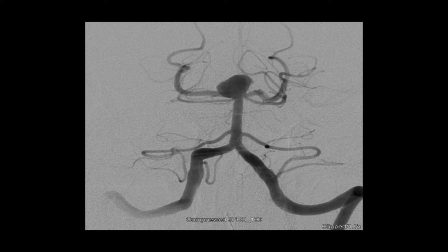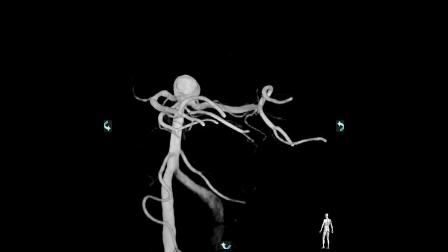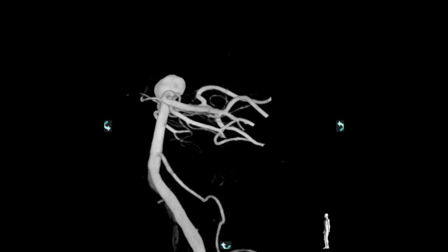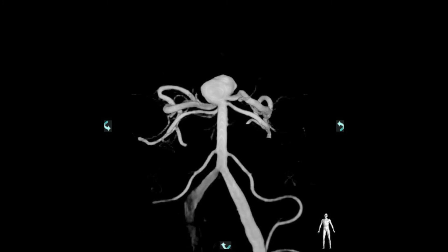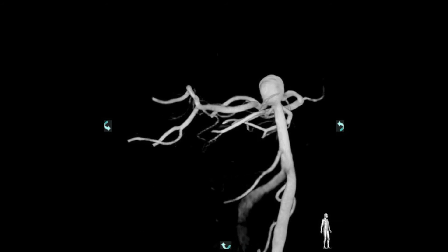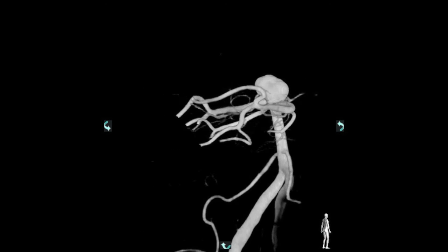On this angiogram — a left vertebral injection — we can see a wide-neck irregular basilar tip aneurysm. On the three-dimensional angiography, we can see the same wide-neck aneurysm.